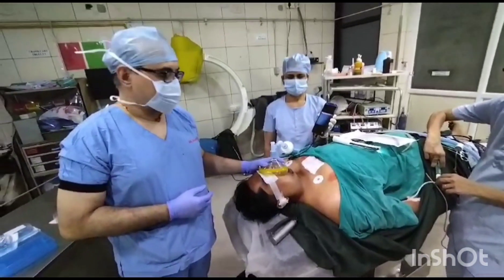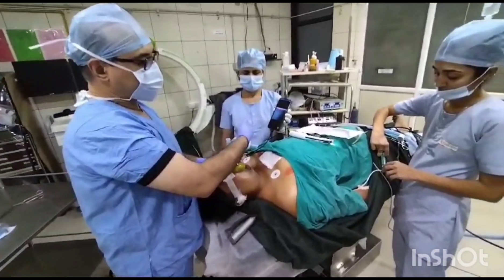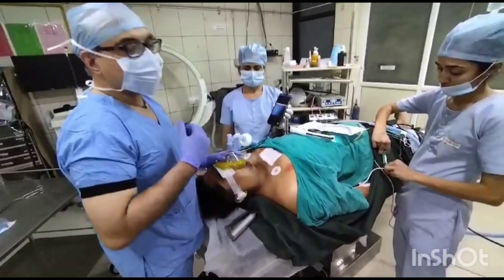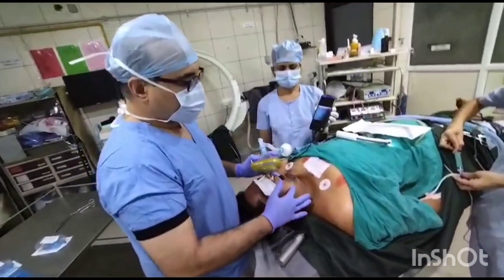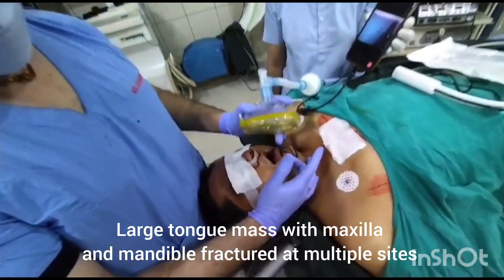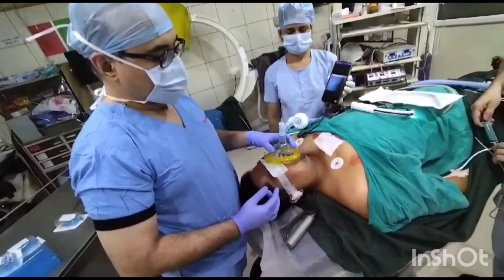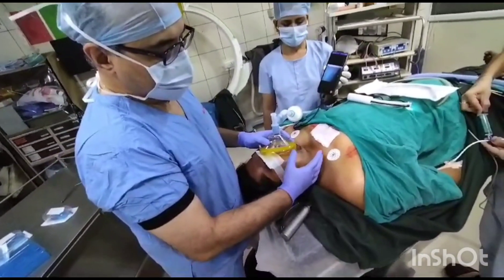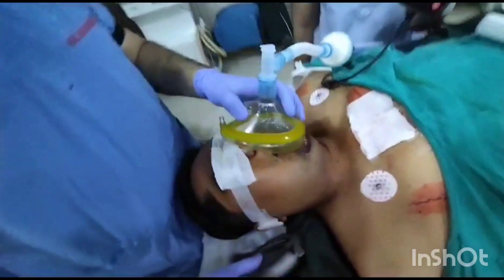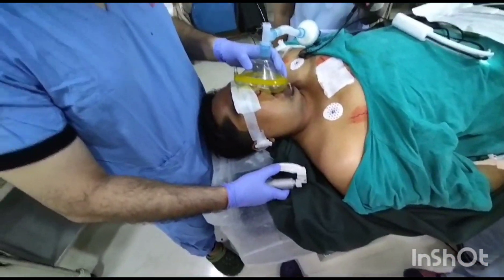He is a polytrauma patient with brachial humerus injury, radio-ulna fracture, and multiple facial bone fractures. He is a multilevel fracture patient, with fracture of the mandible and a large tongue mass. It is not directly possible with our routine McIntosh blade to intubate this patient.